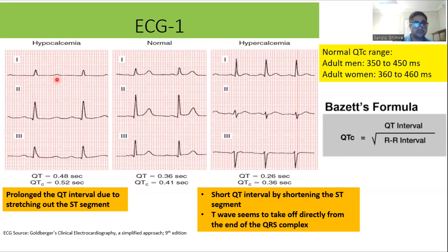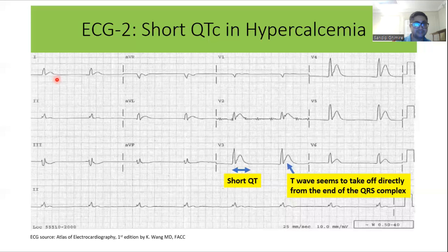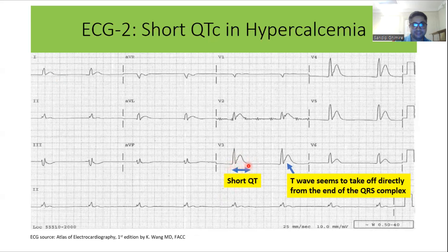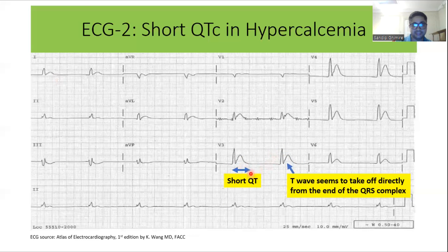This second ECG is of a patient with hypercalcemia. As you can see, the QT interval is very short, and the T-wave appears to take off directly from the end of the QRS complex. These are the typical findings in cases of hypercalcemia.